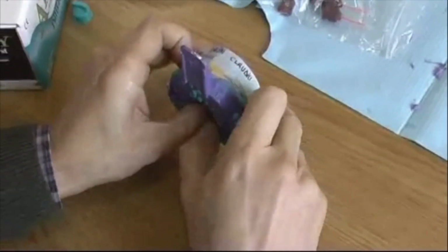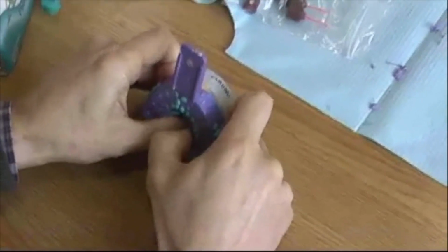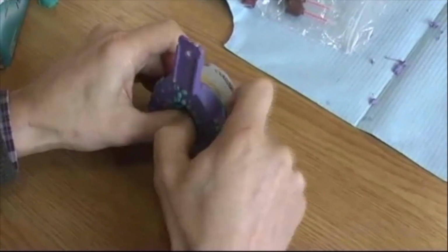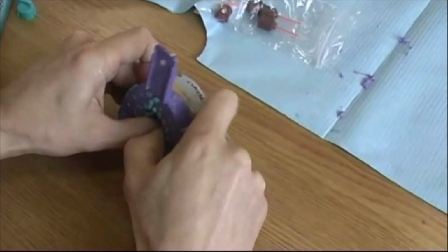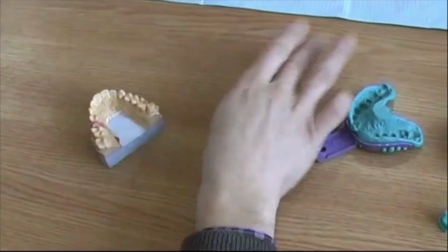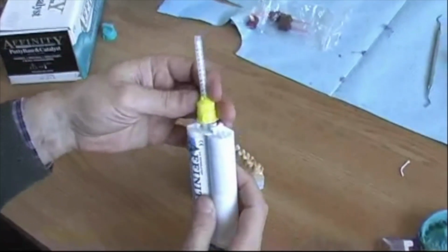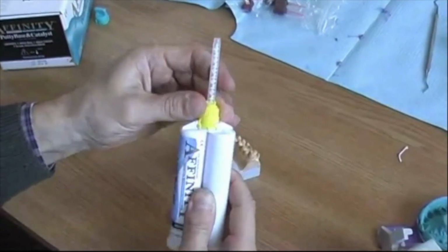So you have to understand, this is what happens in the mouth. But I'm not in the mouth of the patient. Now it's a demonstration on a model. But this is what dentists do in the mouth. Never touch the handle. The handle is just for cleaning the tray, maybe. Okay? From the premolar zone, you push it down. Okay. Now you remove the first cord. That was, again, just to prevent the putty from getting into the details of the preparation of the margin.